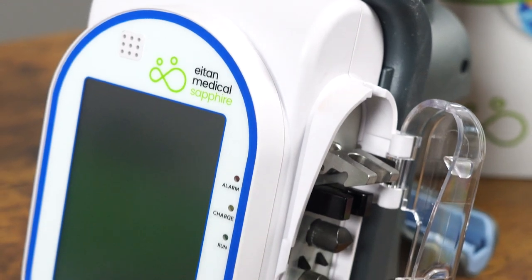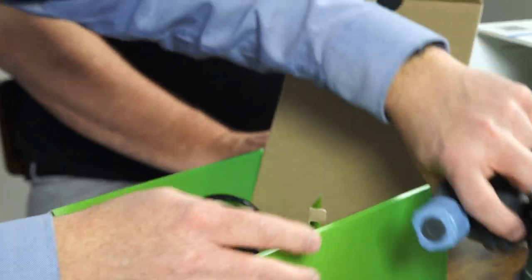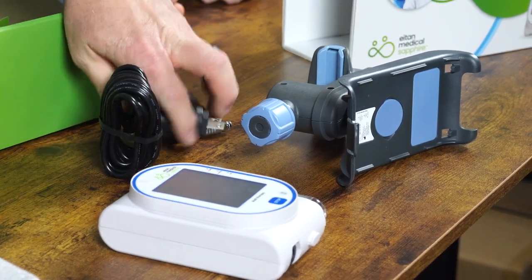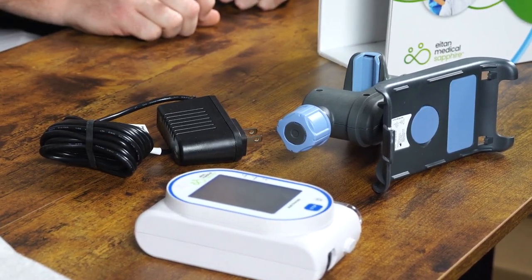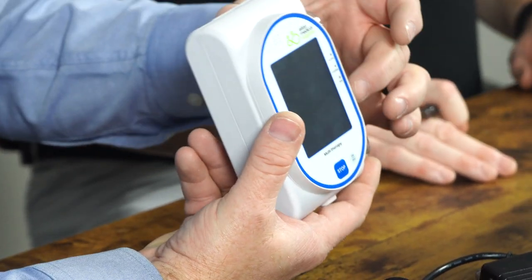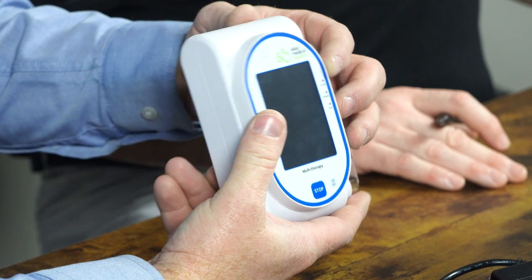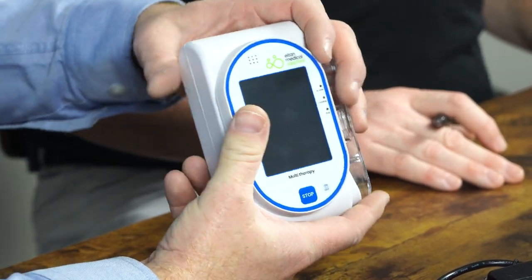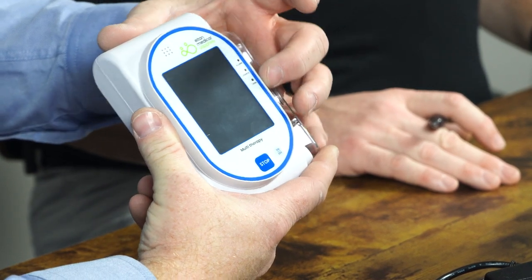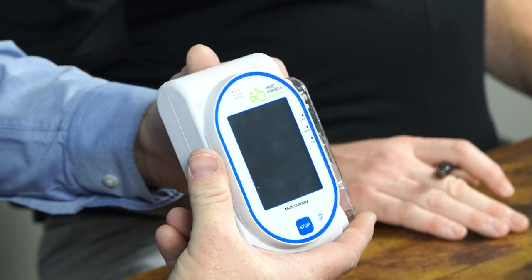The pump itself on the face has only two buttons. There's a stop button, which stops an infusion immediately, and then the on/off button, which powers the device on and off. There are three indicator lights on the left-hand side. The top light is an alarm — anytime there's an alarm during an infusion, you will hear an audible alarm from the speaker and this light will flash red. The next light is a charge indicator. And the bottom light is a run indicator — it will flash green during an infusion.